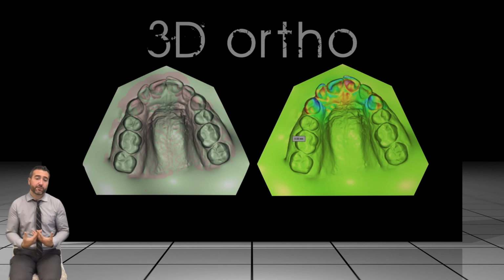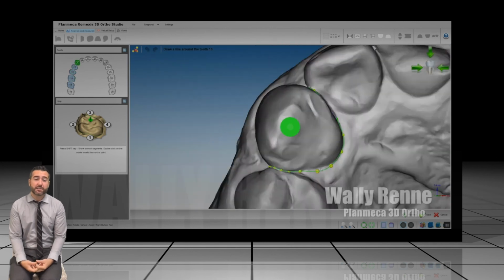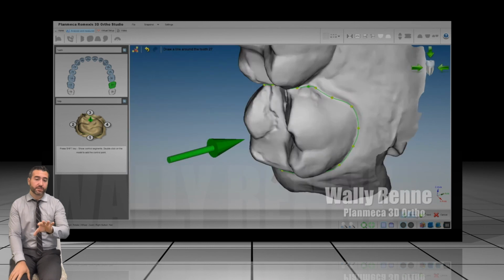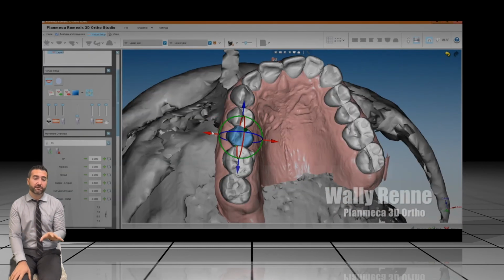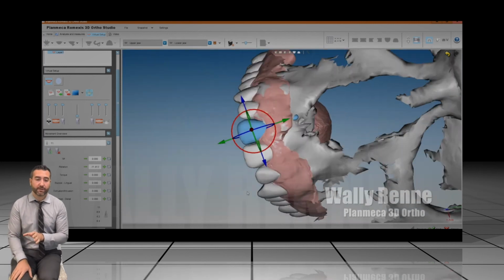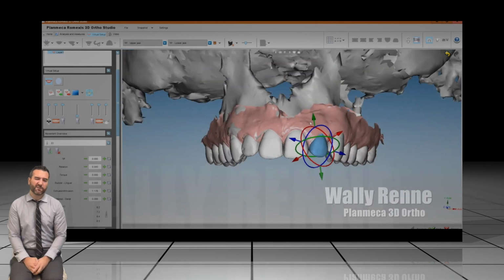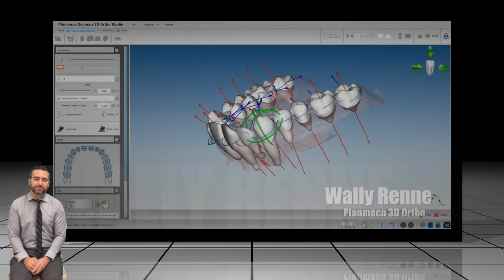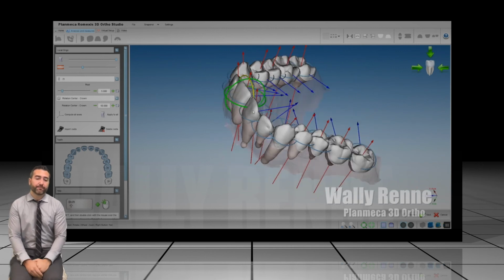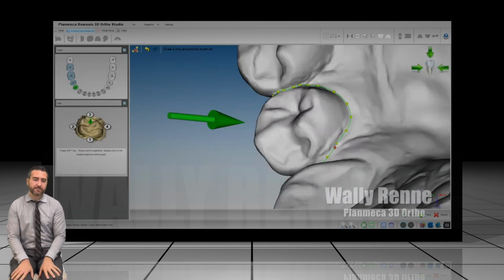3D ortho, we're able to use various different softwares. There's maybe a dozen different softwares that you could design with, or services where if you didn't want to do this tooth segmentation and movement and you were uncomfortable, you could send your intraoral scans to a service who will do it all for you, and you have the ability to check and make comments, and they will send you the files back for like a $250 fee. And then you would 3D print all those files in office and save right around $500 to $800 a case, depending on the case. So here we are. In this case, I'm doing it myself.